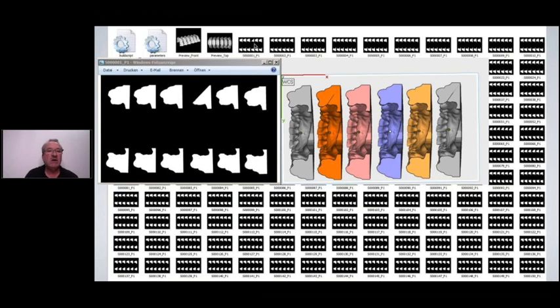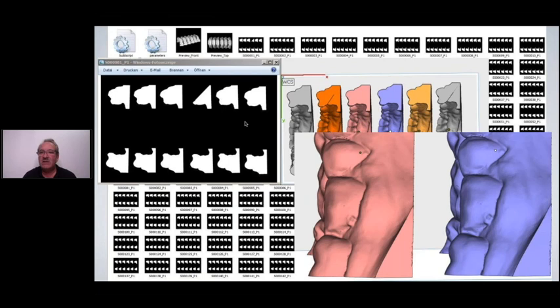And if you have a situation like this, it's only the first 2 slices where you would see something like this. That's why you only check the first and the second slice. The others, you don't worry about. You basically repair it, okay? That means if you look at this model here, which is not accurate, this was the 3rd model here, compared to this model, you don't see a difference.